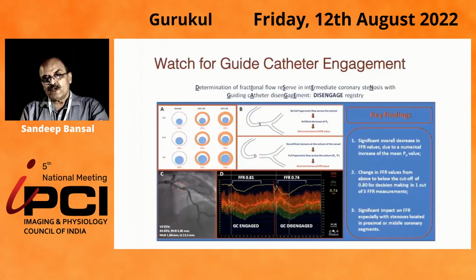In addition, the point that was just made: 2 days ago, one of my residents did an angiography, and he said there is an osteal left main lesion. That was because the left main had gone into spasm and it had gripped the catheter. Now, if we do resting measurements in that scenario, we will get a false value if we do an FFR in that situation. That is the reason I would agree with Dr. Murli that in all cases, hyperemia must be tested.